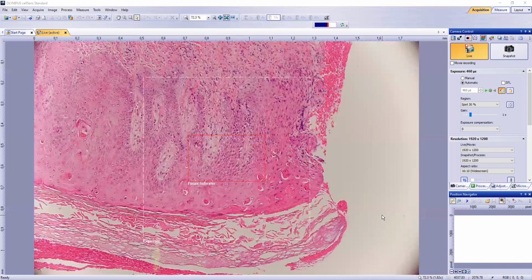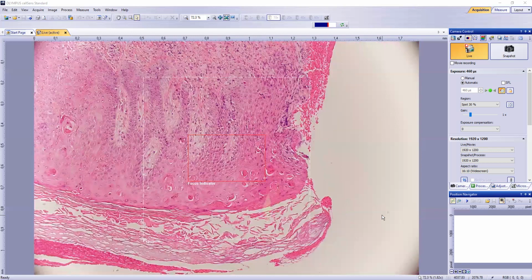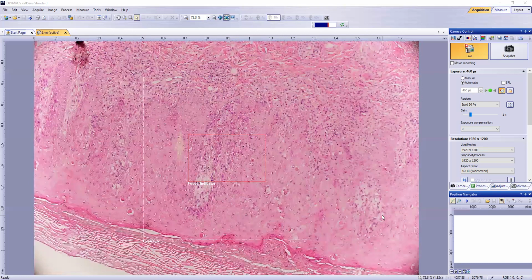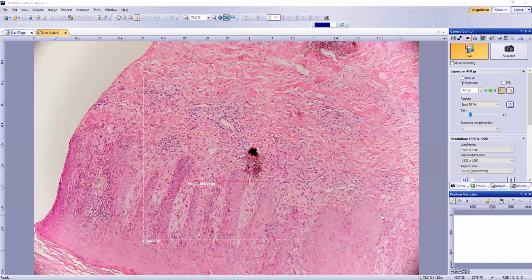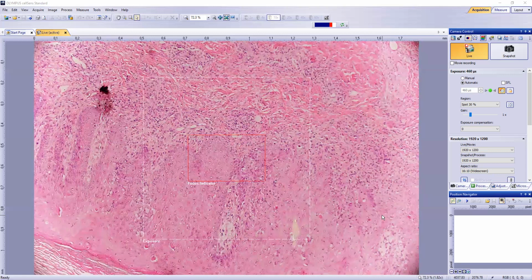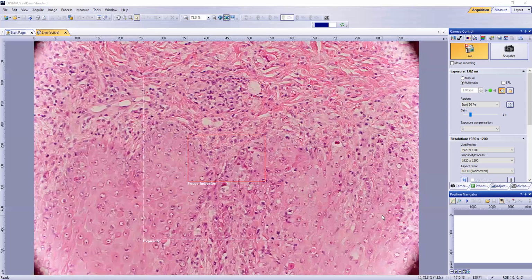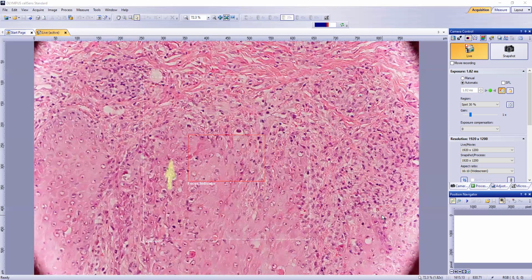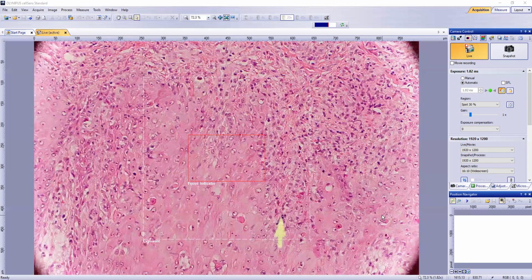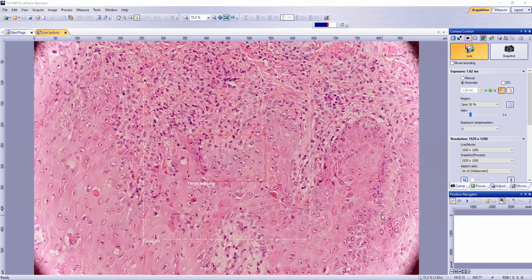Okay, as you can see here, we have a cluster of many apoptotic keratinocytes, but as we scan through, we see many more necrotic keratinocytes. There is a little bit of a lichenoid inflammatory infiltrate tracking along the dermal-epidermal junction. It's not heavy, but it's there, and concomitant with that, we can see some vacuolization of the basilar epidermis as well. Okay, so if we follow the contours of the rete pegs, you can see some vacuolar degeneration of the basilar epidermis.